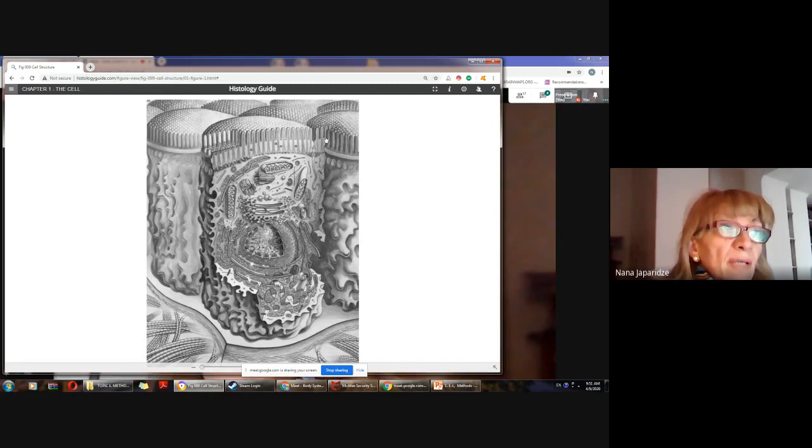So you see that the cells have some type of structural polarity. I'm not talking about the electrical charge. No, I'm talking about the structural polarity. What does this structural polarity mean?